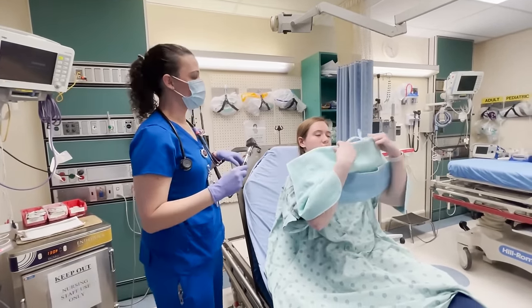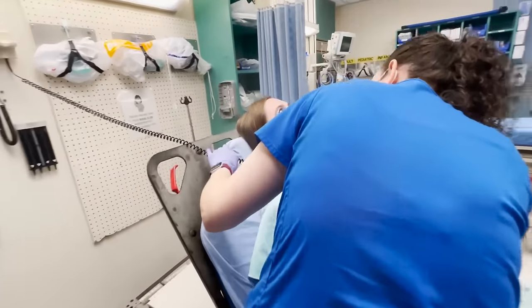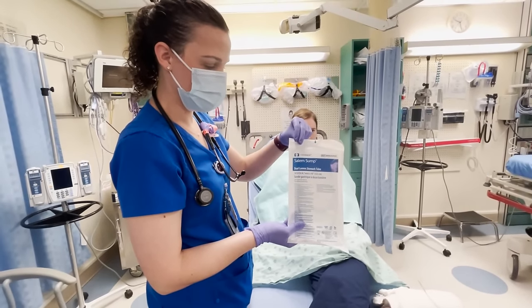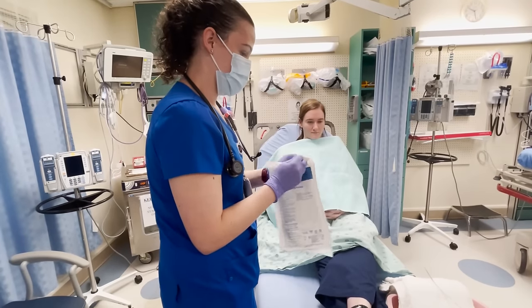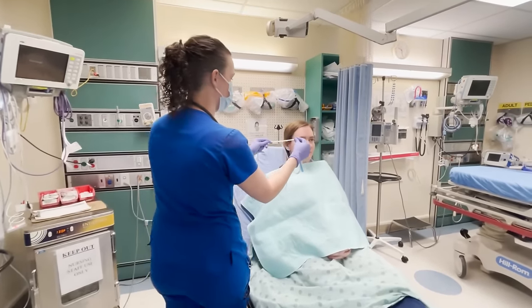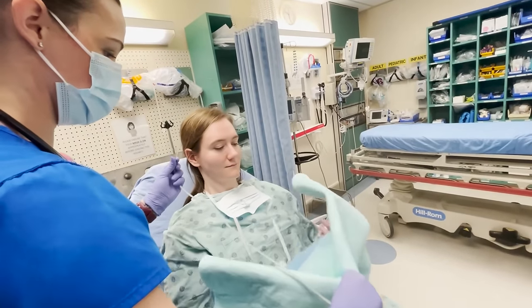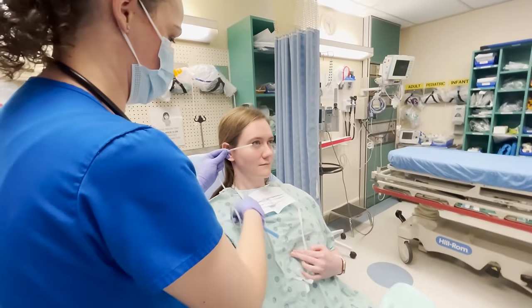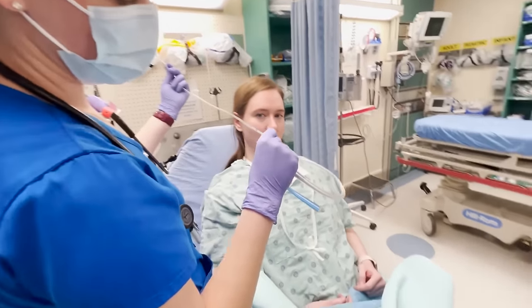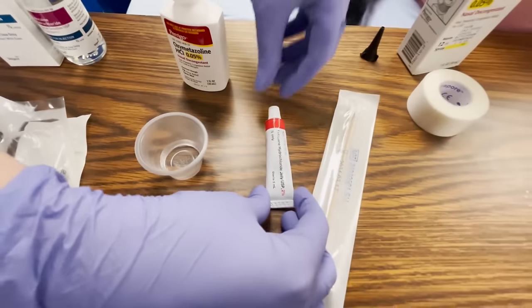Is there any septal deviation? I have a 14 French saline sump NG tube. You're going to start off measuring from the tip of her nose to the earlobe, and then go just below the xiphoid process. We're going to mark right at 64.